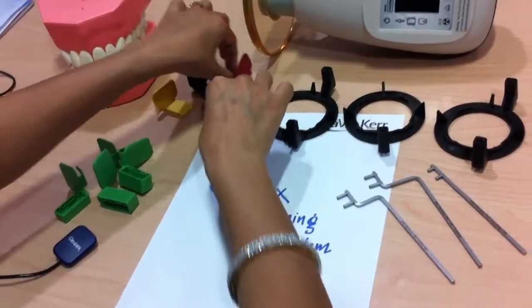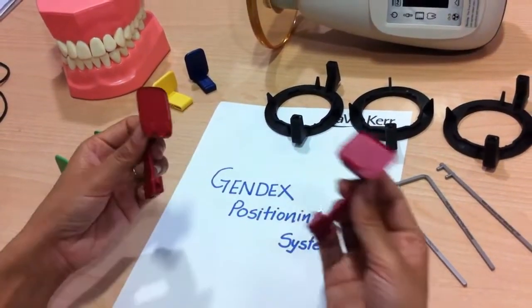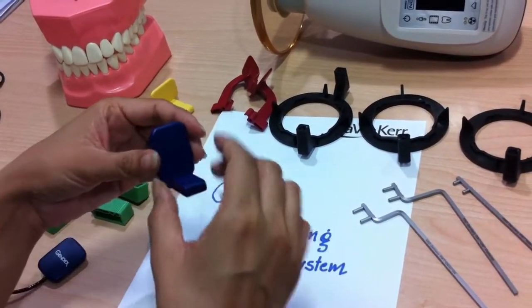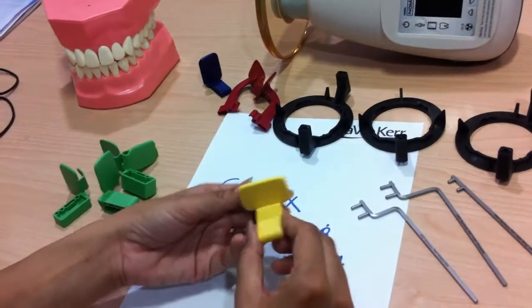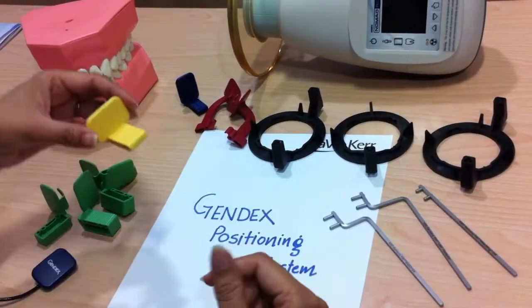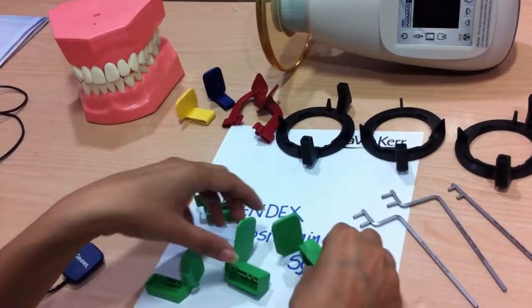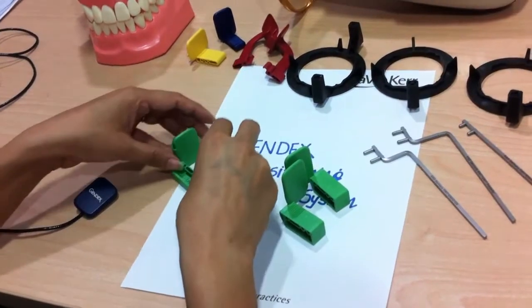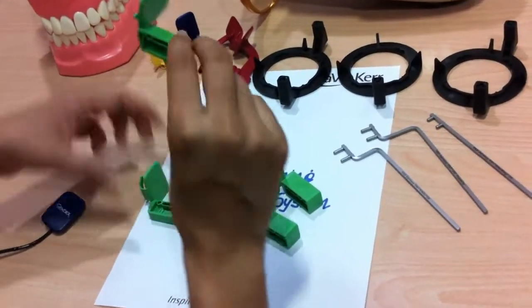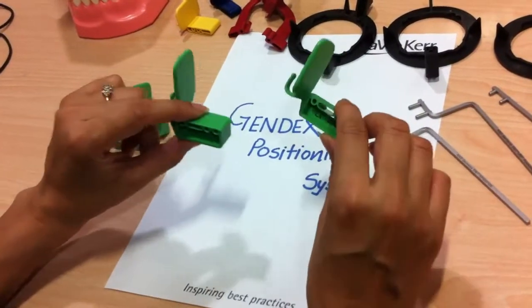The color-coded positioners: red are for bite-wing, with two holders — one vertical and one horizontal. Blue is for anterior, and anterior scans are mainly in the vertical position, so there is only one holder. Yellow is for posterior, and posterior scans are in horizontal position, so there is only one horizontal positioner. Green are for endo scans — two positioners for vertical and two for horizontal, covering upper right/lower left and upper left/lower right combinations.